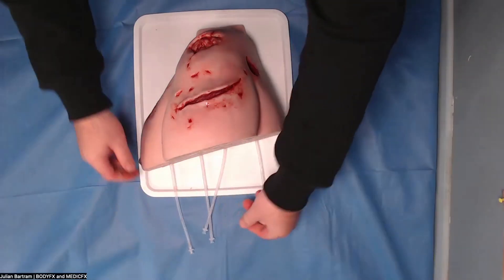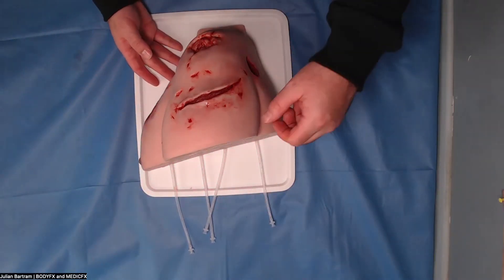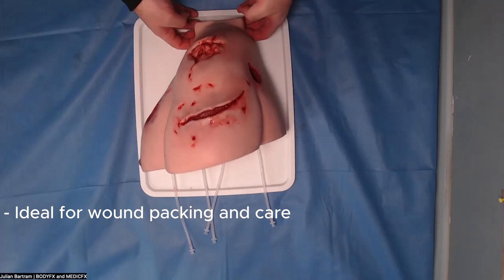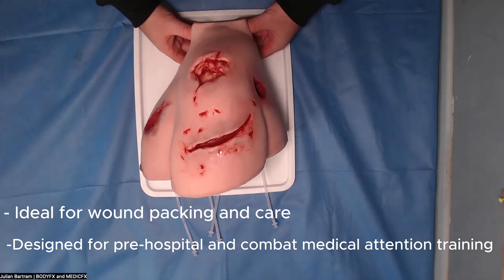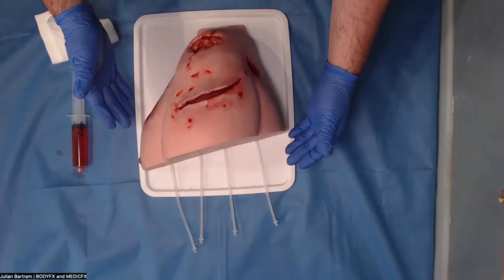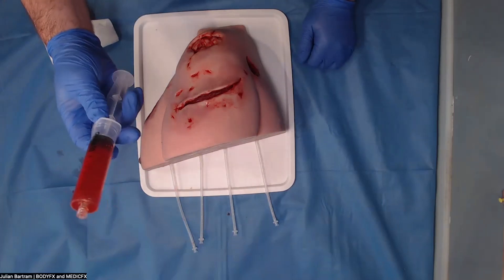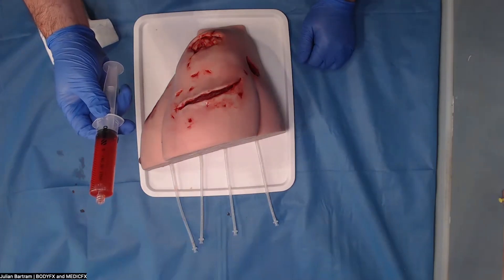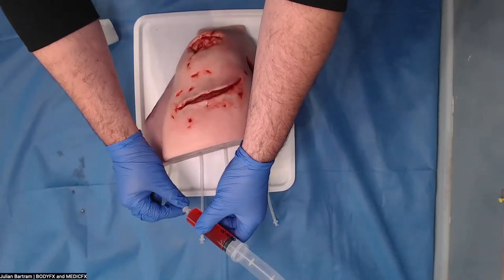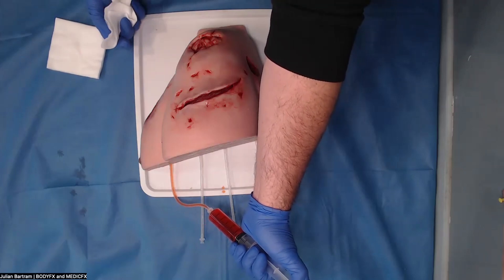Each of these wounds bleeds individually. I will demonstrate that shortly. It's a very good trainer for wound packing and wound care, particularly for the pre-hospital environment or for training combat medics. The model comes in the box with four 50ml syringes. For this demonstration I'm just going to be using a 30ml syringe, which attaches via the standard luer lock connectors here.